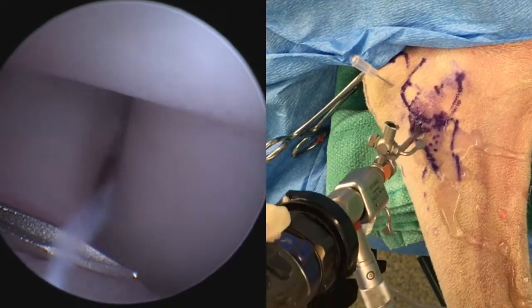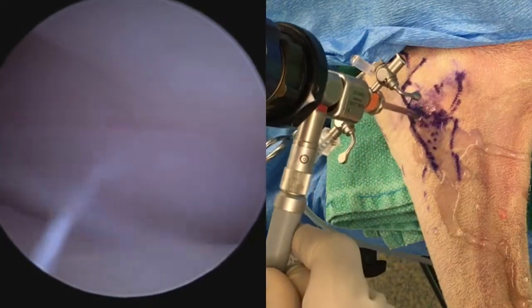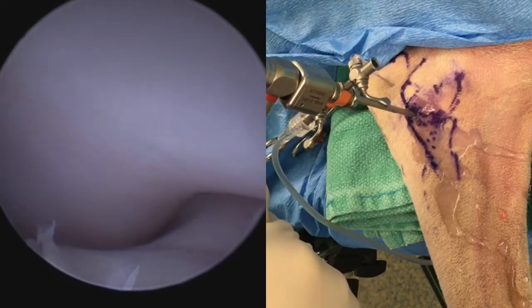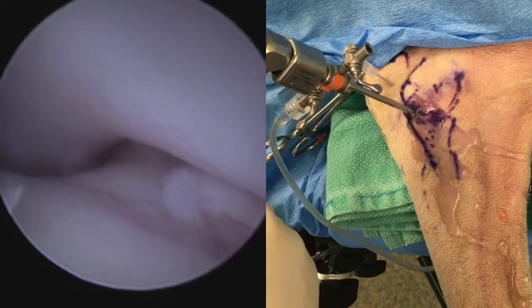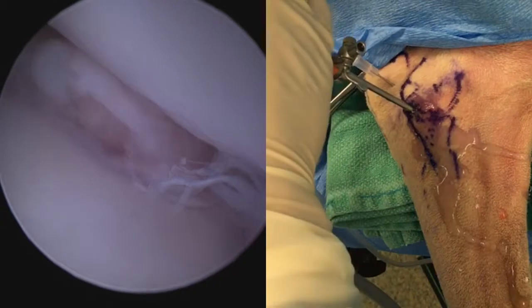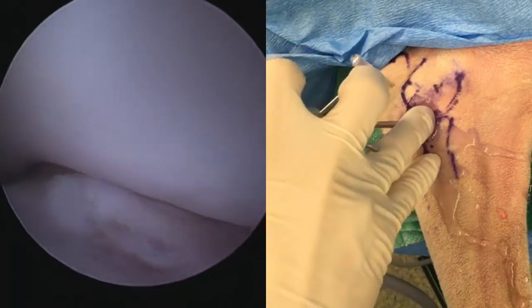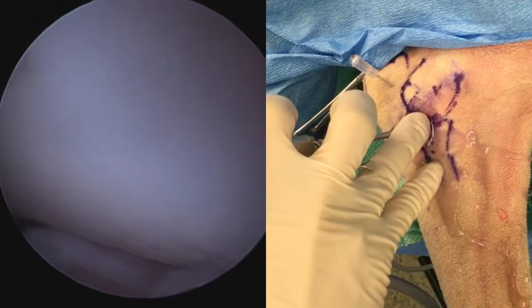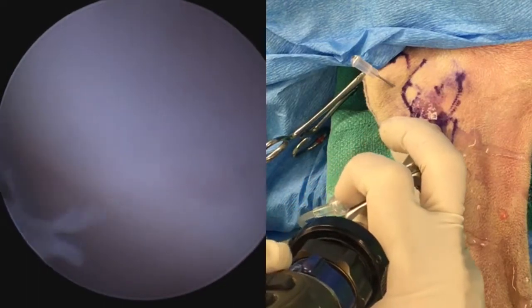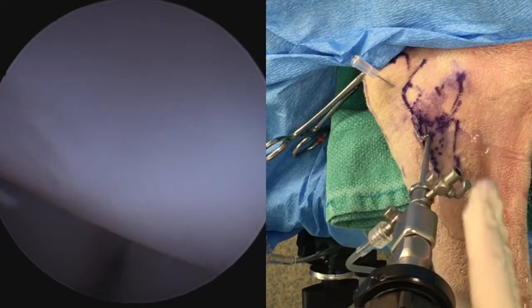We begin sweeping cranially. At the top of the screen we have the humeral condyle, medial aspect. We are now angling the arthroscope to look at the tip of the medial coronoid process. In this cadaveric specimen, we actually have a slightly displaced medial coronoid fragment. We continue the explore, looking up at the humeral condyle and heading back caudally to the level of the anconeal process.